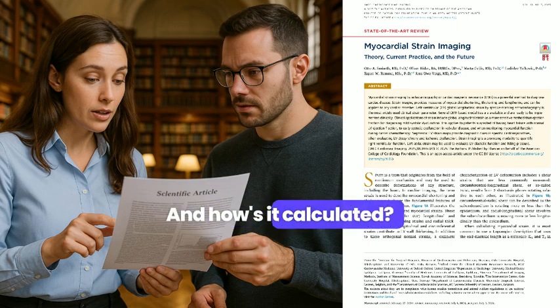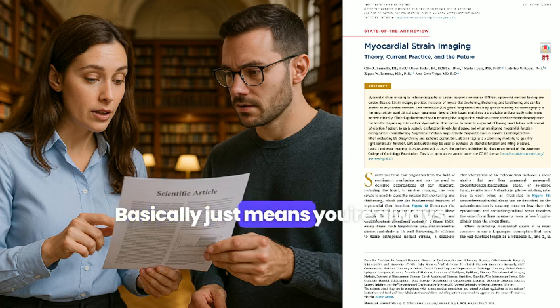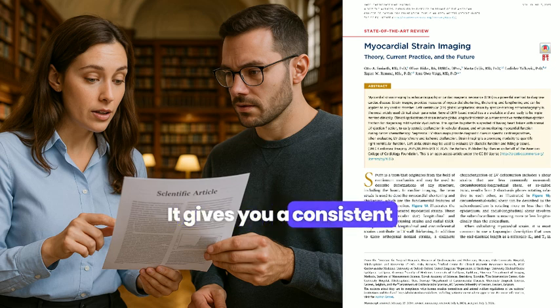And how's it calculated? There was a mention of a Lagrangian description. Yeah. Basically, it just means you're always comparing the muscle's current length back to a reference point. End diastole. The very end of the resting phase. It gives you a consistent baseline, L0, so to speak.